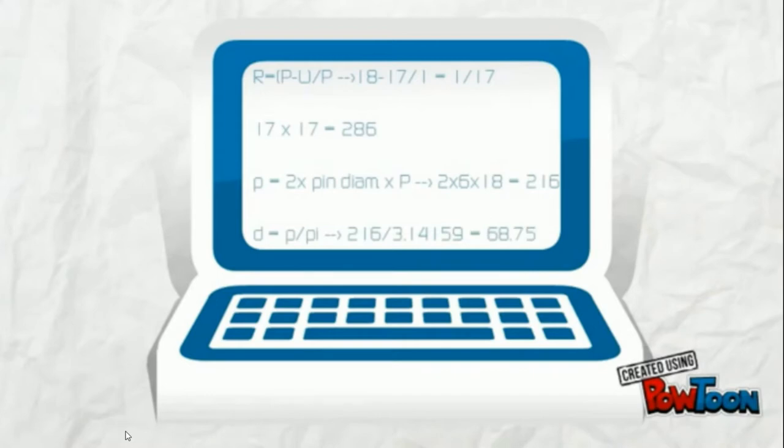And the diameter of the outer disc will be 68.75. How I found it out, you'll find links to different sites if you're interested and to my blog if you want more detailed information.